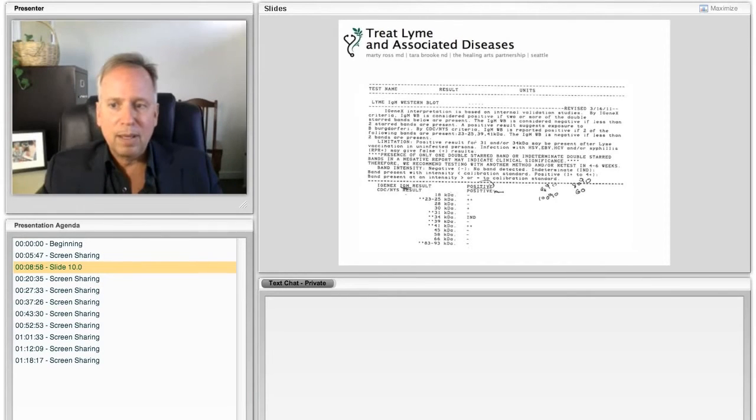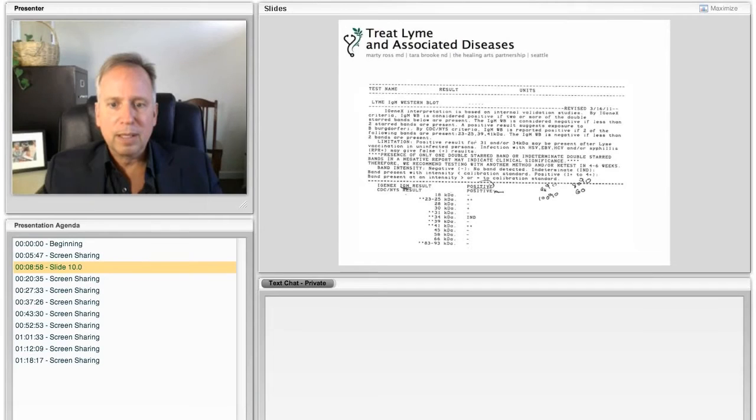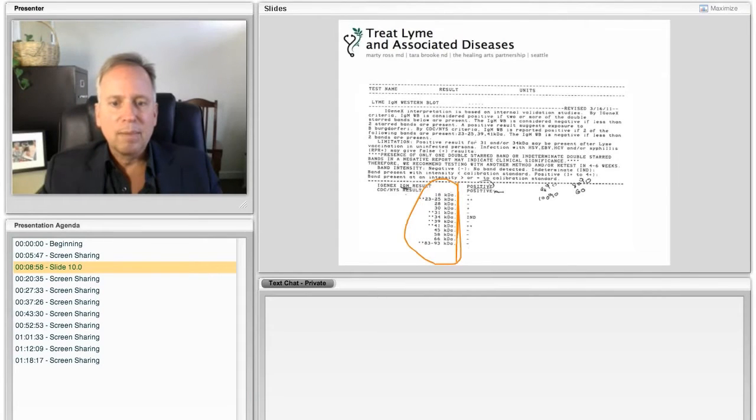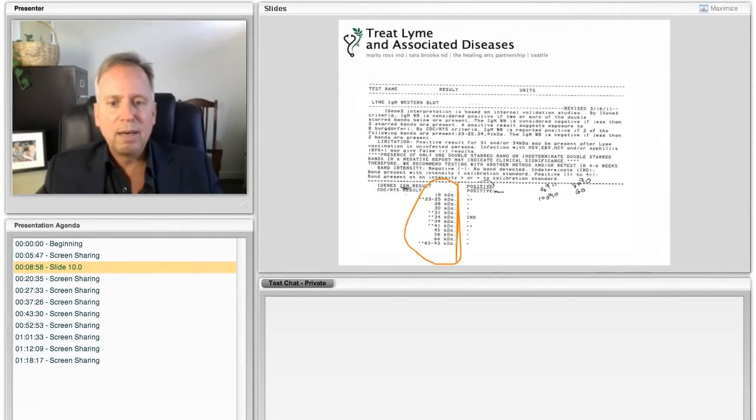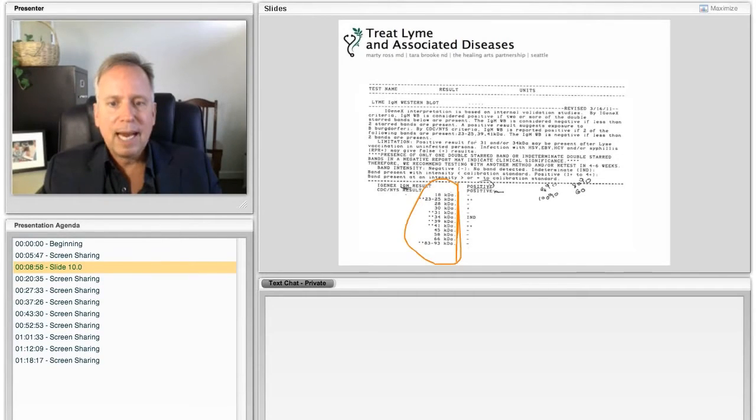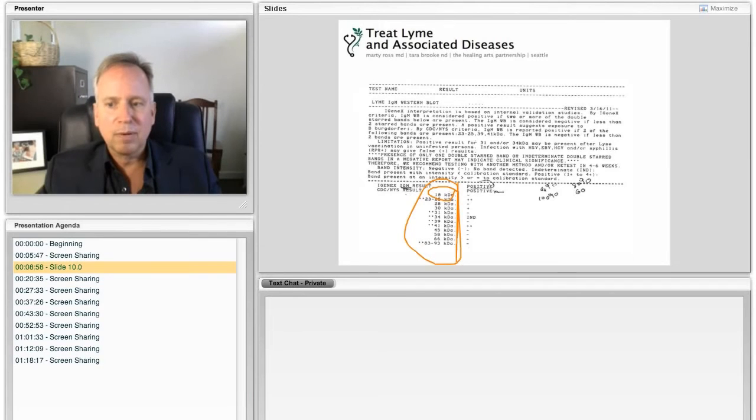So now the second part that I want to show you here is how you interpret this. So I'm drawing a line down the middle here. This side over here, you see all these numbers. What these numbers are, these are the weights of proteins that are found on the covering of the Lyme germ. So there is a protein that weighs 18 kilodaltons. That's what that stands for right there. A kilodalton.